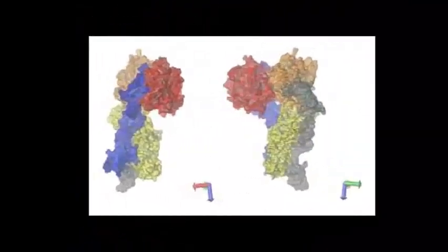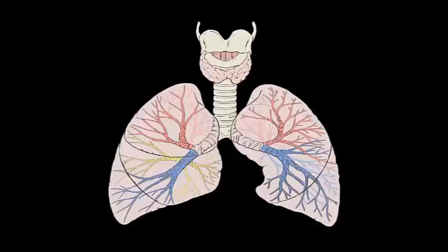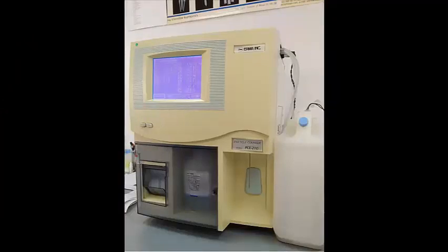There is hemoglobin inside the red blood cells, which combines with the oxygen in the lungs, transfers it to the tissue, and in return combines with the carbon dioxide in the tissues and removes it from the body through the lungs. Standard equations have been used to determine MCV, MCH, and MCHC, which provide information about red blood cell characteristics, the concentration of hemoglobin, and the size of red blood cells.